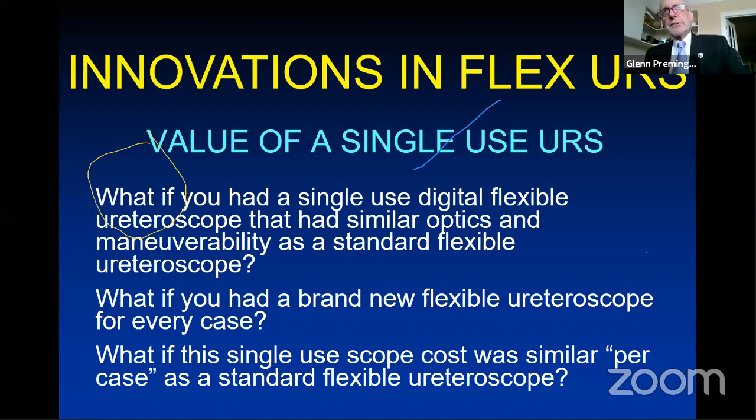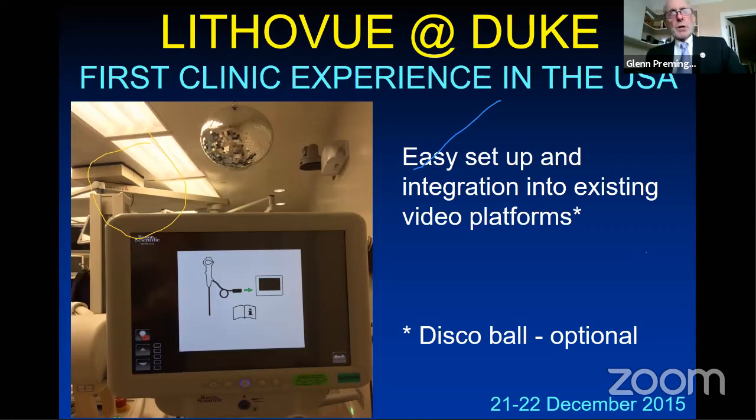So the whole concept of a single use digital flexible ureteroscope was introduced over 10 years ago with the thinking that the value of a single use scope was significant. What if you had a single use digital flexible ureteroscope that had similar optics and maneuverability as a standard flexible ureteroscope? What if you had a brand new flexible ureteroscope for every case? And what if the single use ureteroscope cost was similar to a standard flexible ureteroscope? Well, we had the good fortune to work with Boston Scientific, and 5 years ago was the first institution in the Americas to perform flexible ureteroscopy with the first single-use flexible ureteroscope.